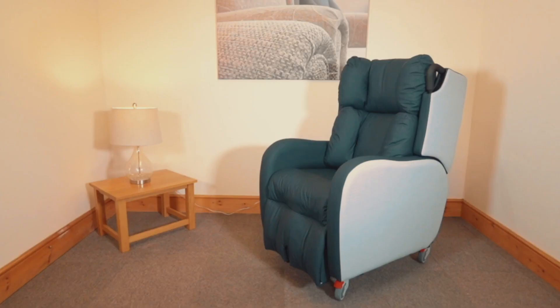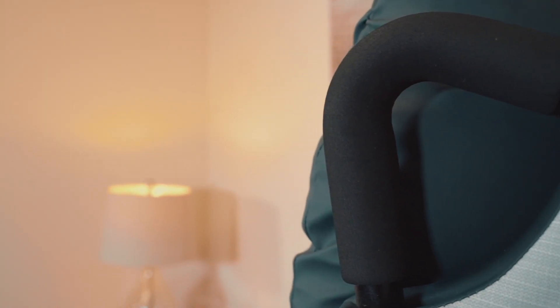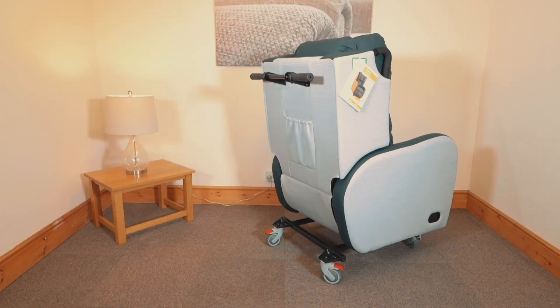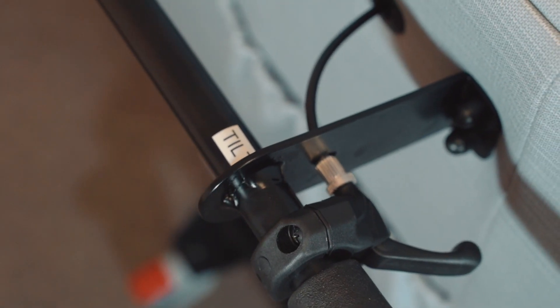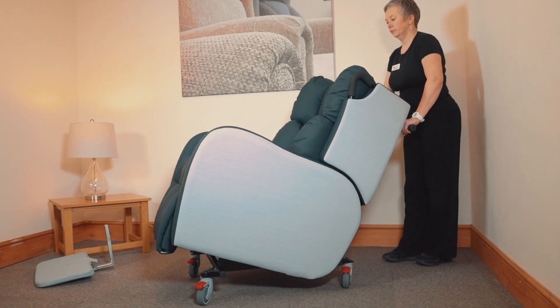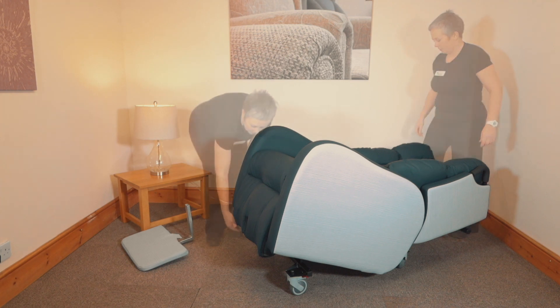Hi, this is Justina from Stuart Mobility, and today we'll be looking at the Boston Porta Chair from Repose Furniture. The Boston Porta Chair can be manual or electric, it comes in three sizes, and has a 20 stone weight limit.